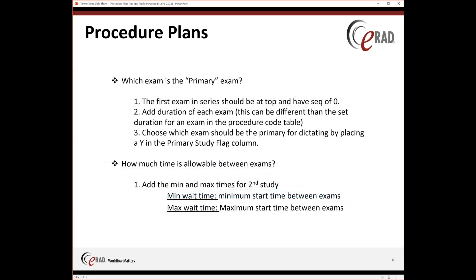Which exam is your primary exam? The first exam in your series should be at the top and have a sequence that equals zero. You also want to add duration to each of these exams — this only comes into play if it's going to be different than what you already have set in your procedure code table. If you leave that blank, it will automatically default to what you have there. You're going to want to choose which exam will be your primary exam for dictating by placing a Y in the primary study flag column.